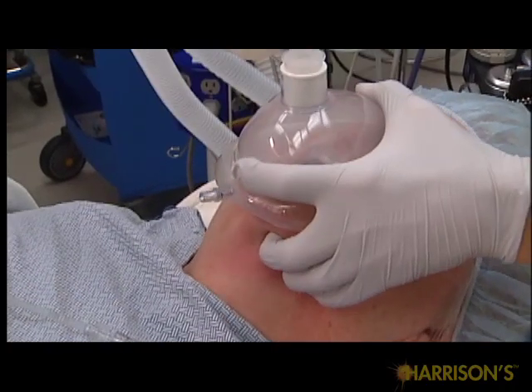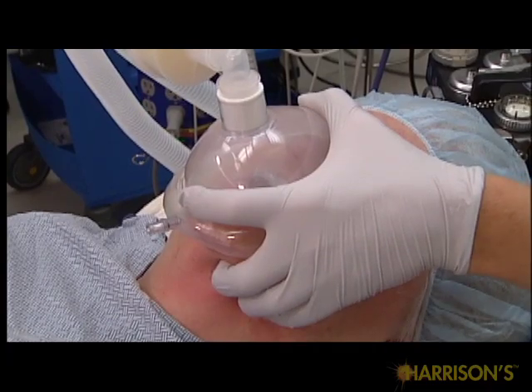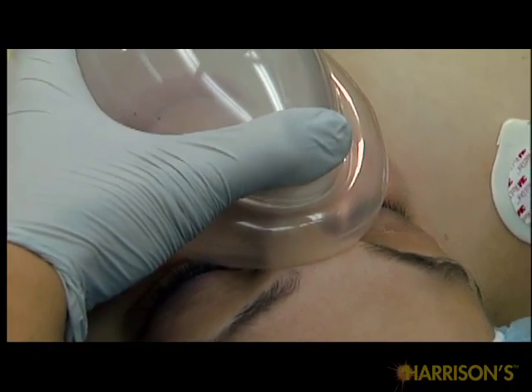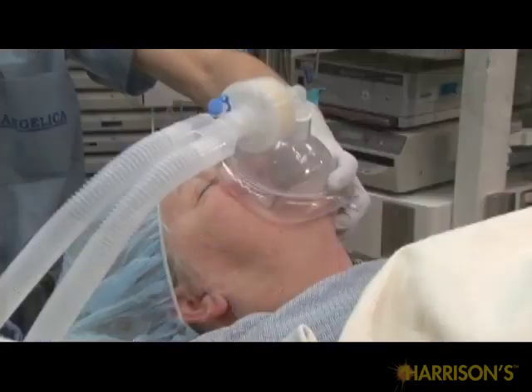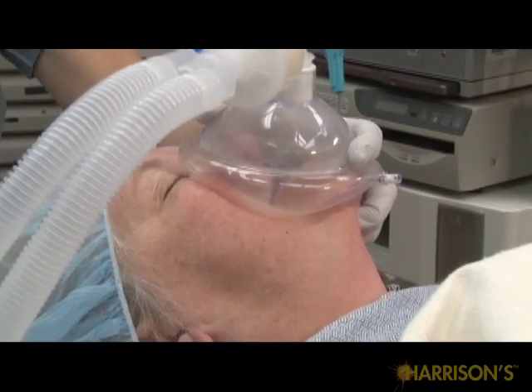For proper mask ventilation technique, allow the left thumb to rest above the connector and the index finger below the connector on the mask. Apply the tip of the teardrop-shaped mask to the nasal bridge. Firmly hold the left mandible with the third and fourth fingers of the left hand. The inferior rim of the mask should rest between the patient's lower lip and chin.